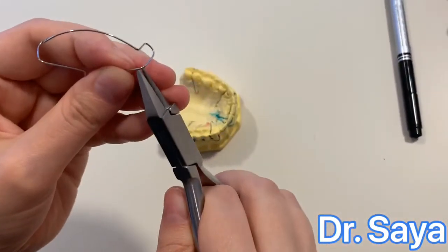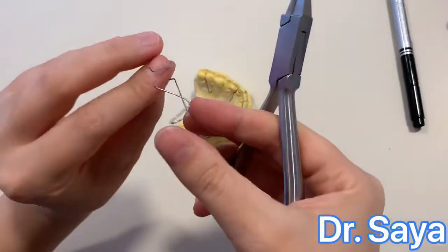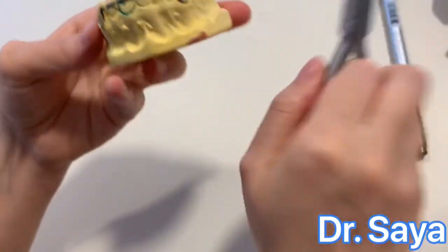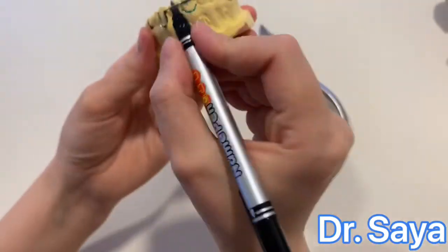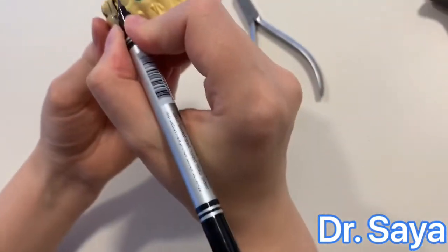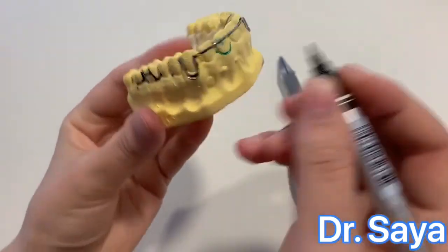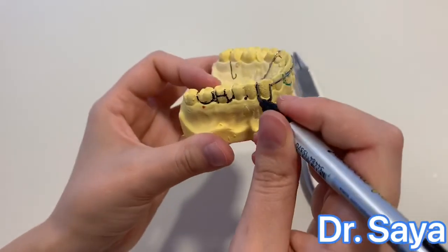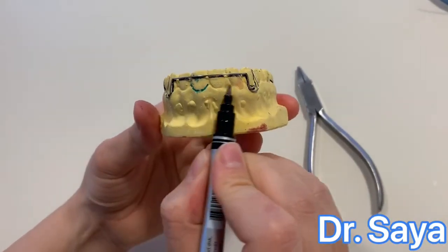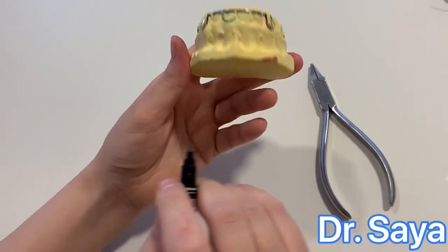The retentive tags should be one millimeter away from the palate. To summarize: the incisal segment runs from the buccal groove of the canine to the buccal groove of the canine, seated on the incisal third of the tooth. There are two vertical U-shaped loops passing approximately between the canine and first premolar, and a retentive tack. The incisal segment should be adapted to the anterior tooth surface. Thank you.